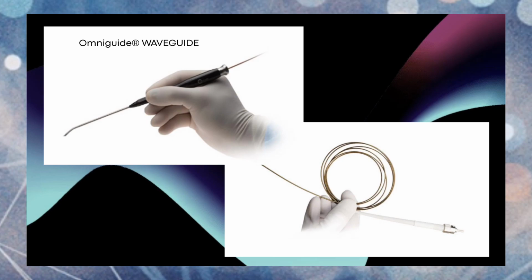And the waveguides are very expensive, and they are single use, and they are completely not able to be reused. You know, one of the advantages, well, there are a few advantages of the waveguide. One advantage is that you have handheld control, and you don't have to wear anything other than clear eye protection.